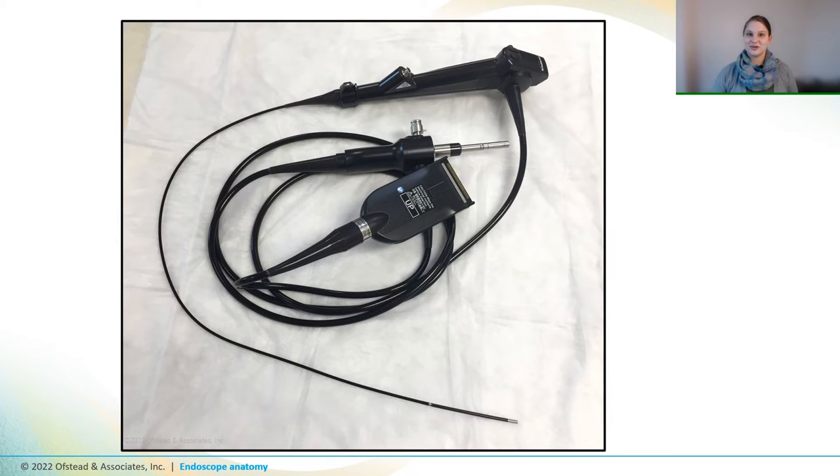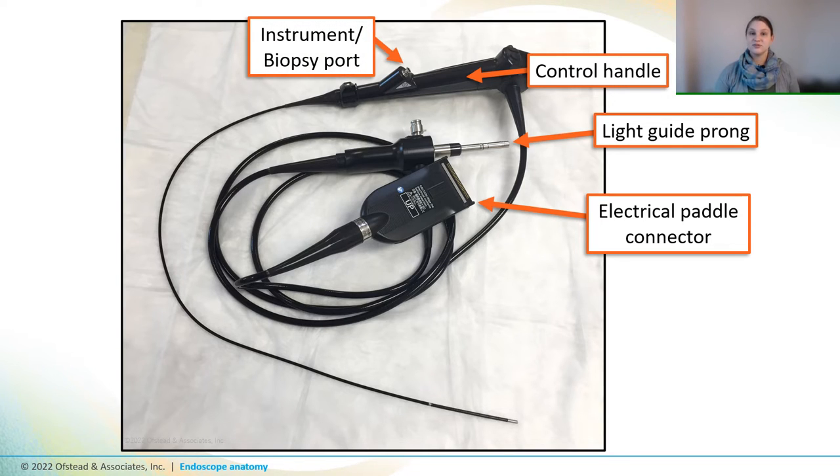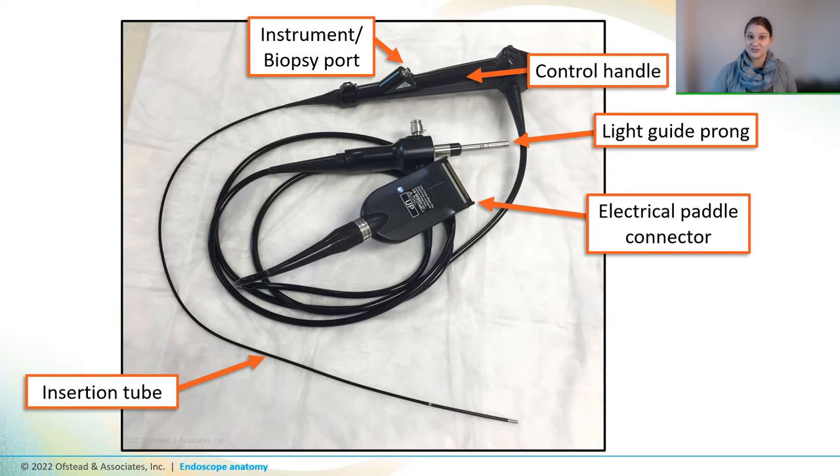Now let's look at the outside of some non-GI scopes. This is a ureteroscope used for procedures in the bladder and kidneys. It has a light guide prong and an electrical paddle connector that plug into the tower and connect to the control handle that lets the endoscopist control the bending section and use suction or flush with water with a similar instrument port to what we saw on that GI scope. The insertion tube of a ureteroscope is really tiny, just a fraction of the size of a colonoscope. And that's because it needs to be small enough to be threaded into the bladder through the natural orifice down there, where tiny is a good thing, and then passed through the kidney tube and into the kidney to help urologists remove stones or treat other kidney diseases.